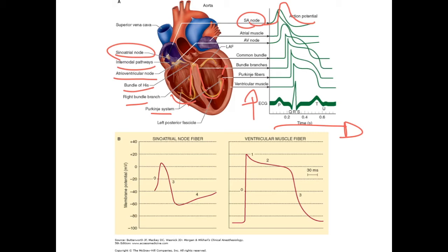So as you can see, for each electrical activity listed up here through time, based on when it is activated, the timing of the peak of the millivolts is different.